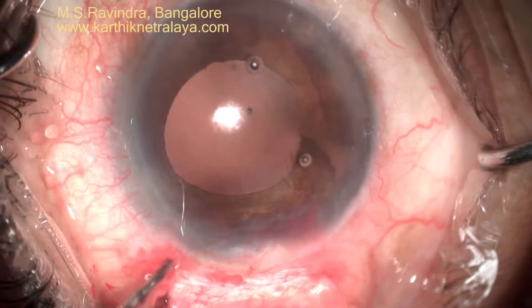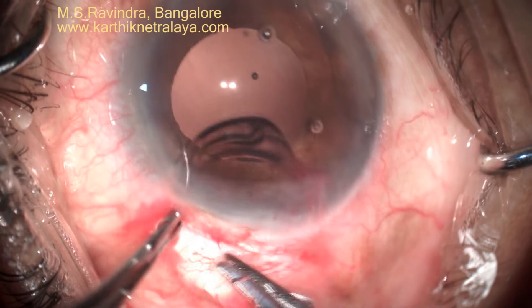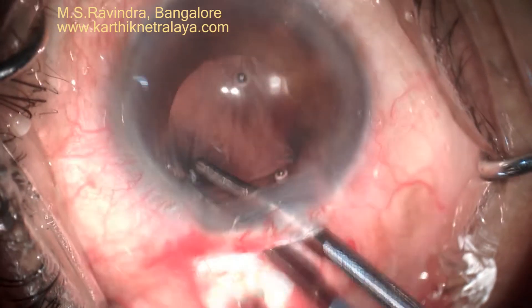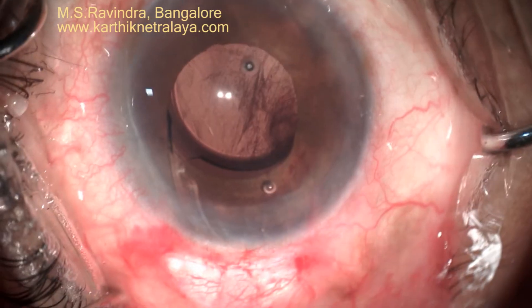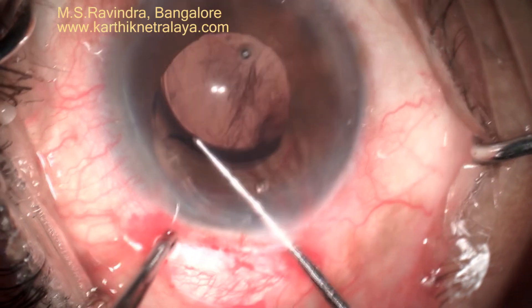The posterior capsule is polished and the lens is placed. There is no need to fold the lens because the incision is of adequate size. This keeps the quality of optics to the highest possible extent. The IOL is placed inside the capsular bag.